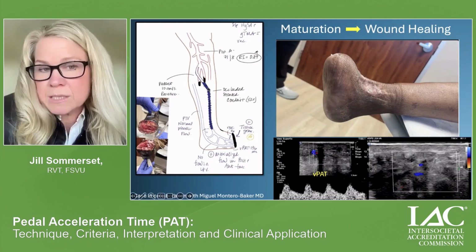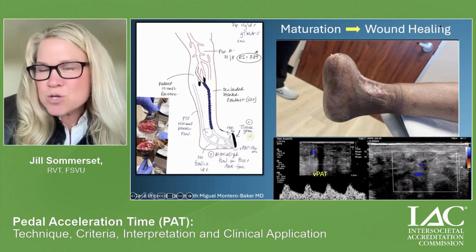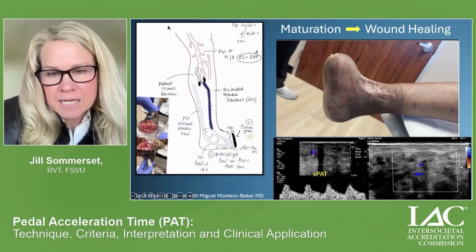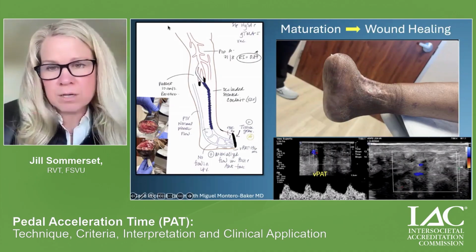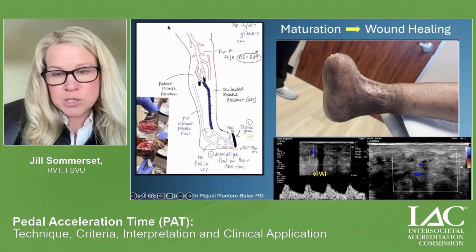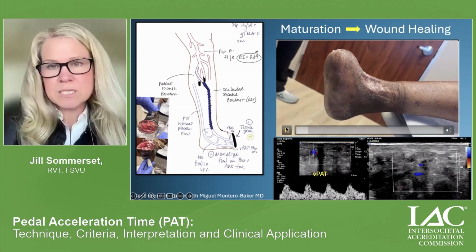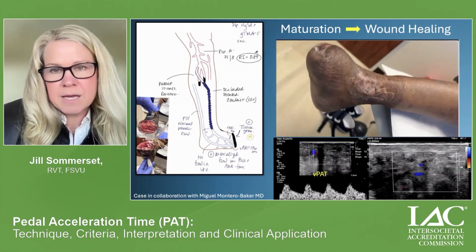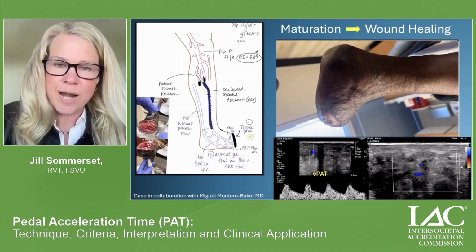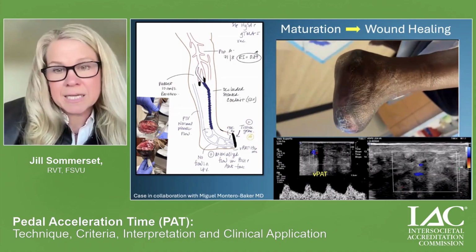The DVA ultimately went down, as they do, but there's something new in the world of DVA that we're using: pedal acceleration time for DVA patients. And this is something called pedal venous maturation. You can see even within a closed DVA, this patient had arterialized flow to the new neovascular network, and she ultimately healed a forefoot amputation and a heel wound.